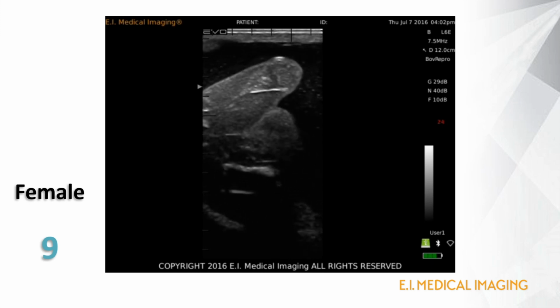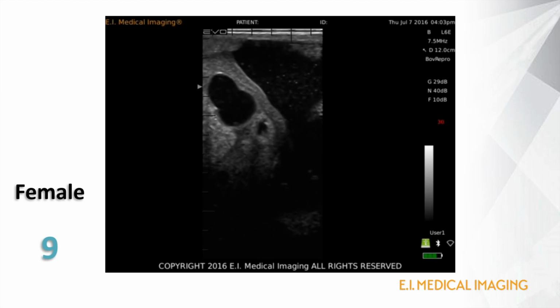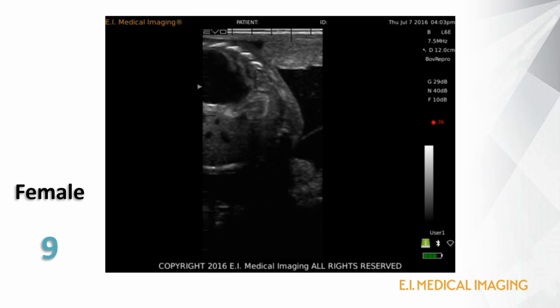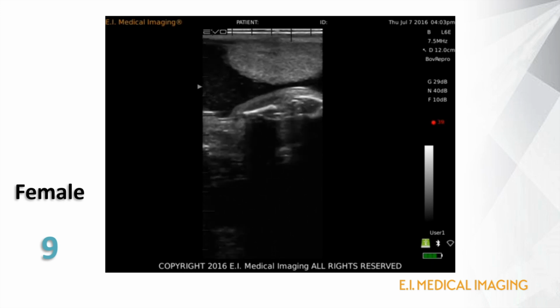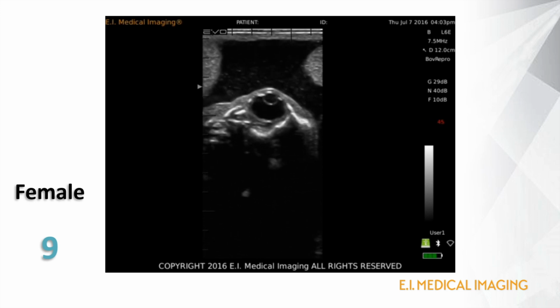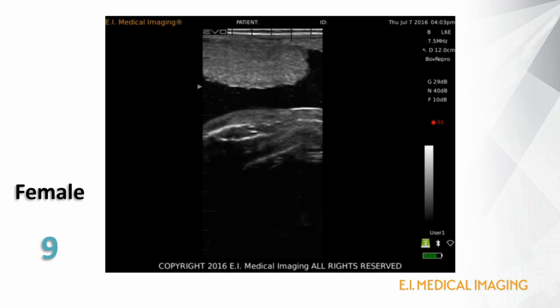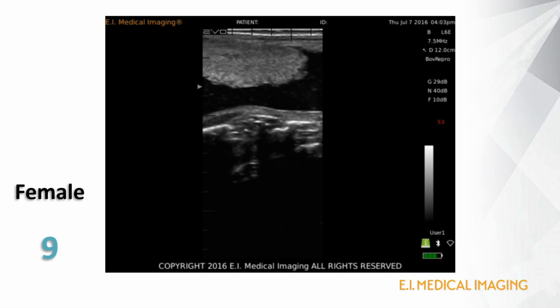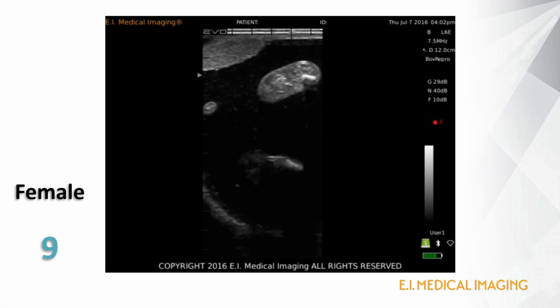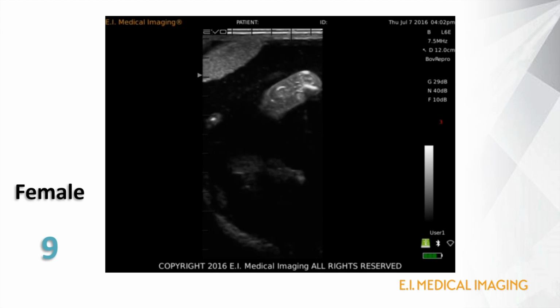In this clip, the operator is taking a nice tour along the fetal body, looking at the abdominal organs, and the beating heart, and even a nice view of the eye where the lens can be seen. The gender diagnosis is made right at the very beginning of the loop. Here we're able to see a female GT to the left, with the muscle of the hind limbs seen branching out to the right. This is a heifer calf.